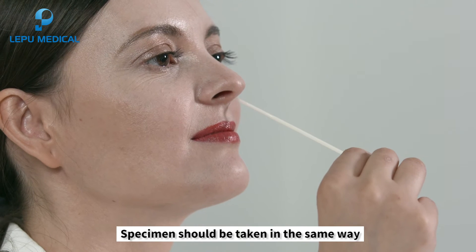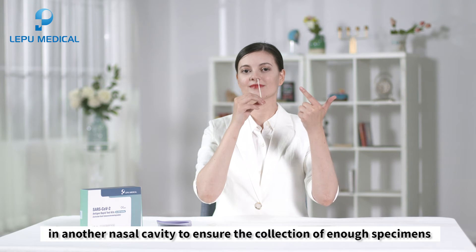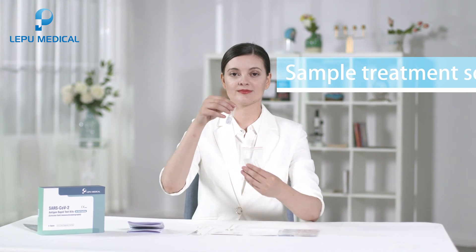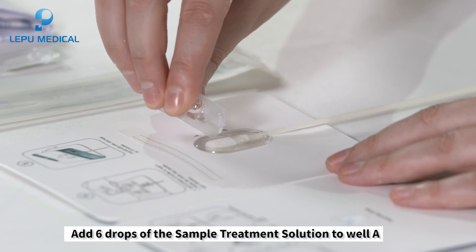Specimens should be taken in the same way in another nasal cavity to ensure the collection of enough specimens. Insert the swab into well A from the bottom of well B, keeping the card flat on the table. Add six drops of the sample treatment solution to well A.